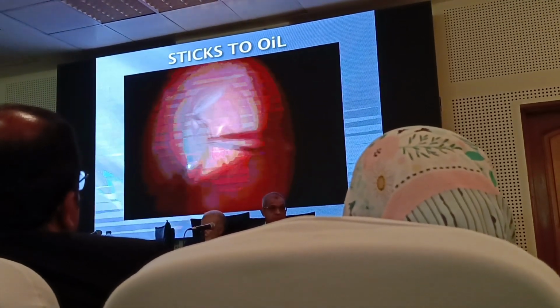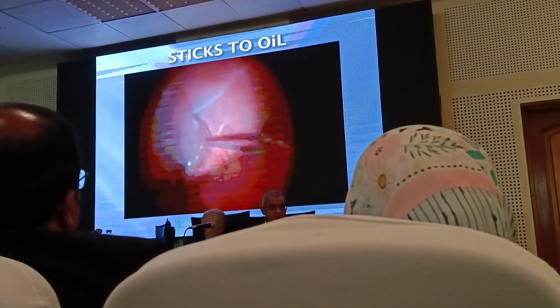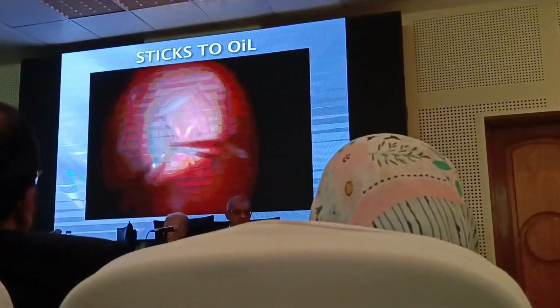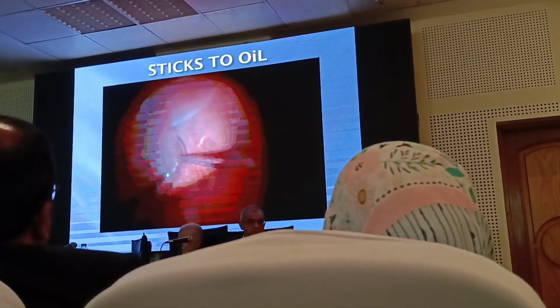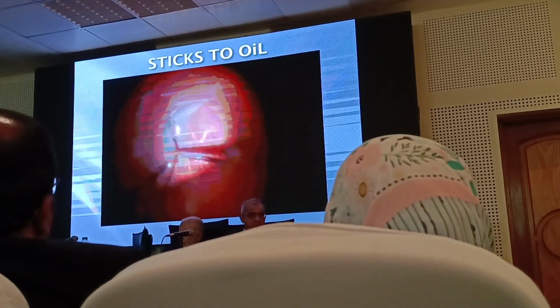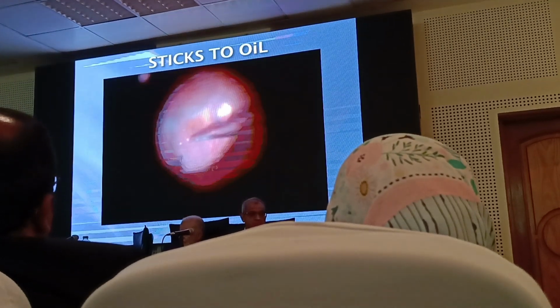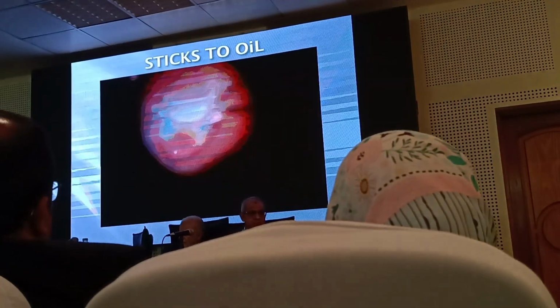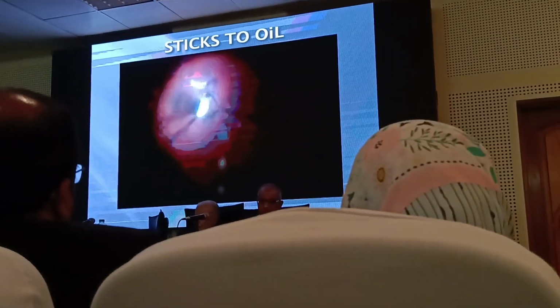In this case, I found this problem, and I found a meniscus of perfluorocarbon underneath the silicone bubble that is now posterior. I just sucked the low viscosity perfluorocarbon. This allowed silicone to float, and I could remove silicone from the anterior part of the vitreous cavity.